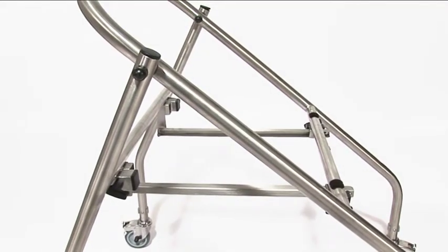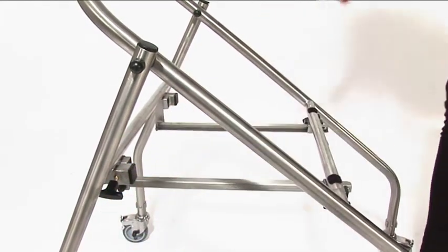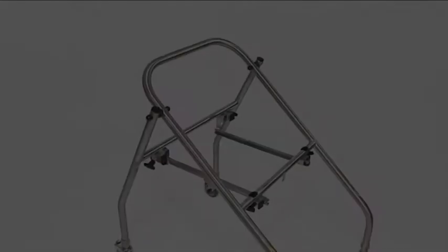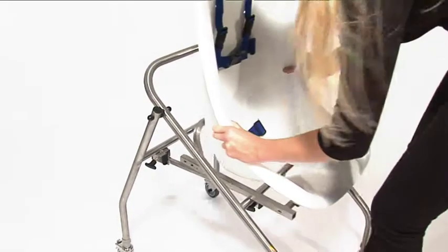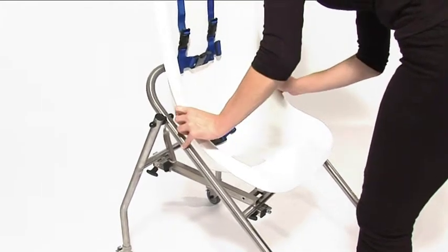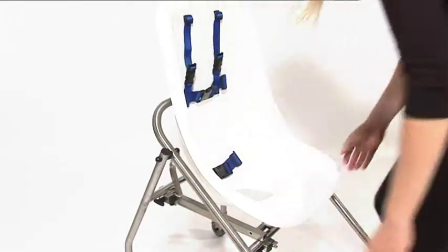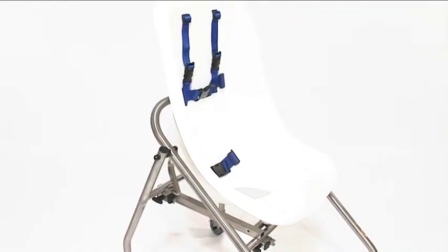To fit the toilet seat to the mobile frame, pull the spring plungers until they can be angled and locked into a disengaged position. Offer up the Chaley seat and insert the tubes on the rear of the seat into the fixing points on the mobile frame. Release the spring plungers, ensuring that they are fully engaged into the locating holes.